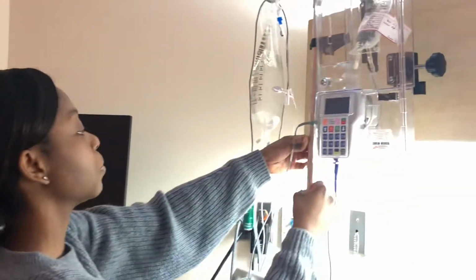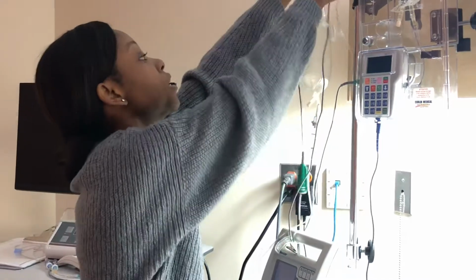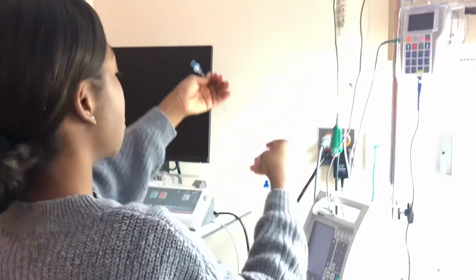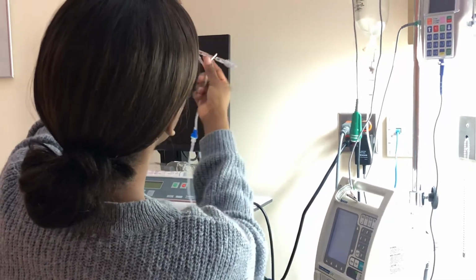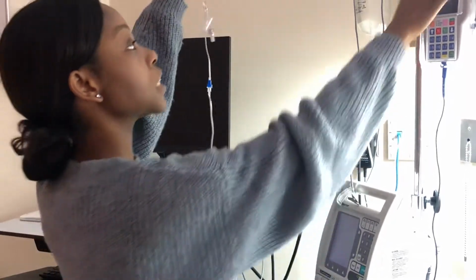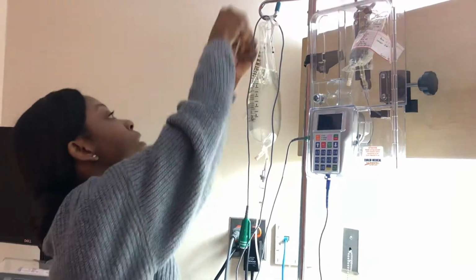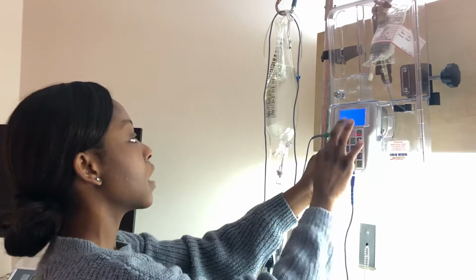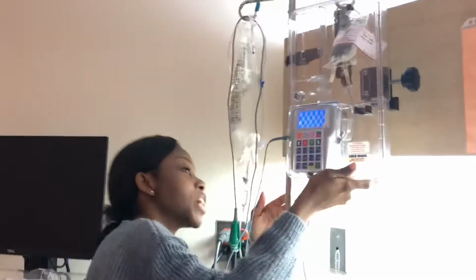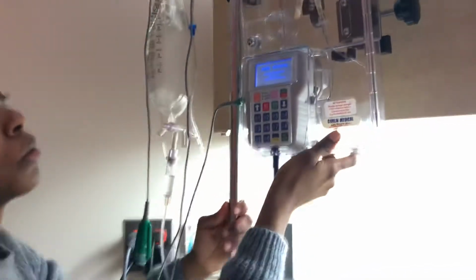So after I've done my first check, I'm just gonna check the tube. So this is the right tube for PCA. And so there's no port, and it is primed, but I'm going to double check, and the setting is right, so it's already there. So now I am going to turn on this, and I'm going to check the back for the code 9462.